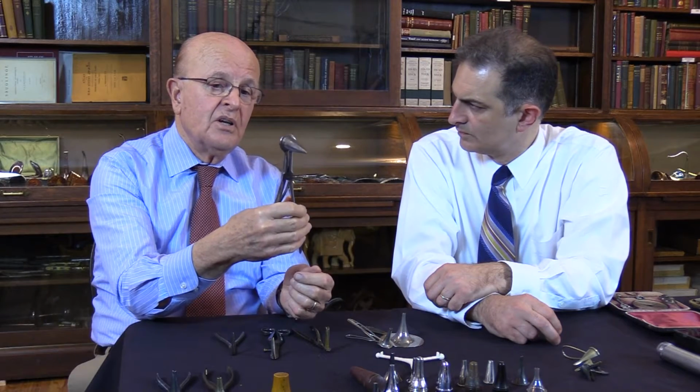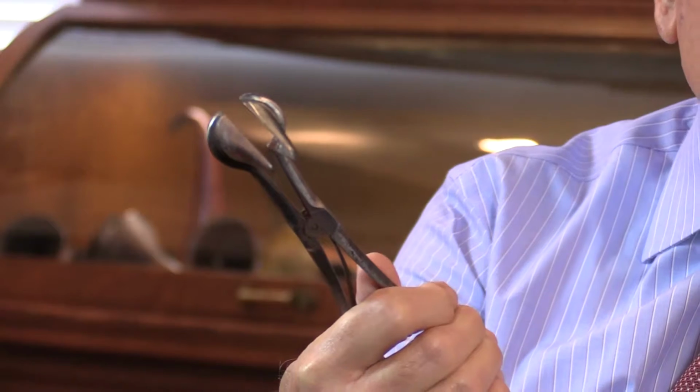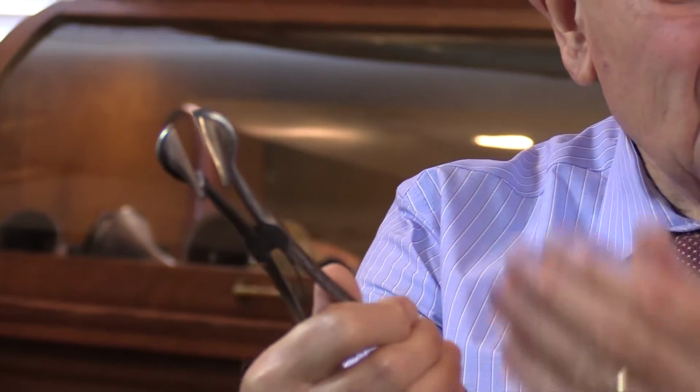For instance, this is about late 17th century, early 18th century. It's called the Hildeness ear speculum. Look how big it is. Just introduce it to the ear canal, spread it. And I believe I read somewhere that this is done mainly to remove a foreign body from the ear, not to really visualize the eardrum, because they were not at the stage that they wanted to see the eardrum or go beyond. So this is an old Hildeness.